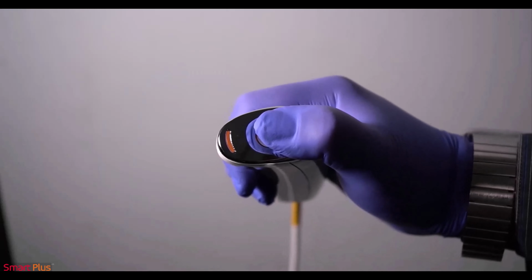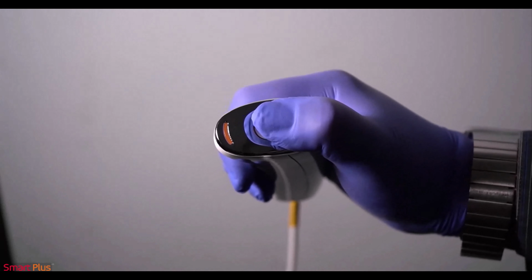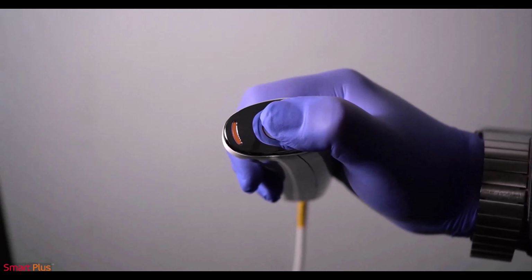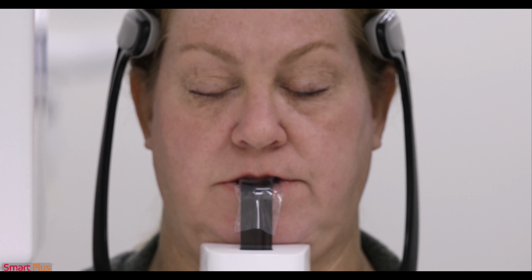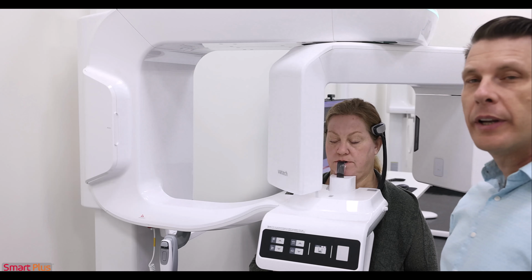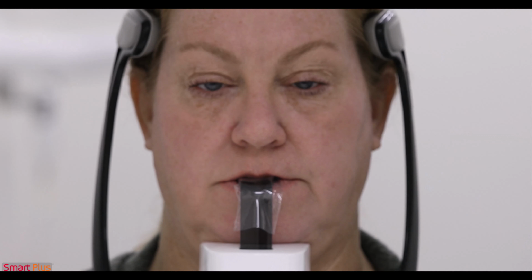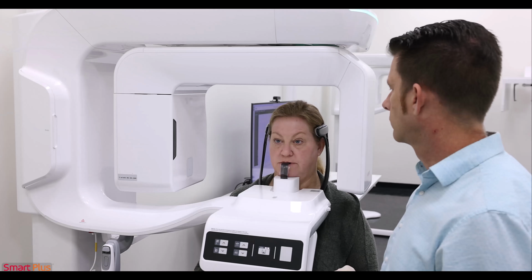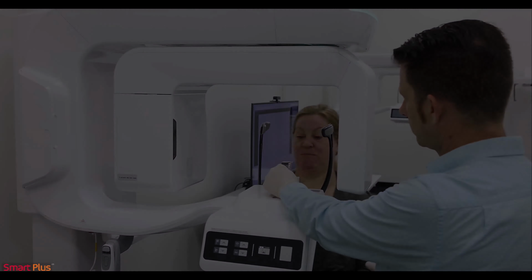Hold the button on the acquisition trigger switch, which will turn yellow when exposing. Hold the button until the image acquisition is fully complete. Image capturing is complete. Please wait a moment. Once capturing has been complete, we can come back in and let our patient out of the machine once the temple supports open. Please open your eyes and follow the operator's instructions. Go ahead and open and go ahead and take a step back.